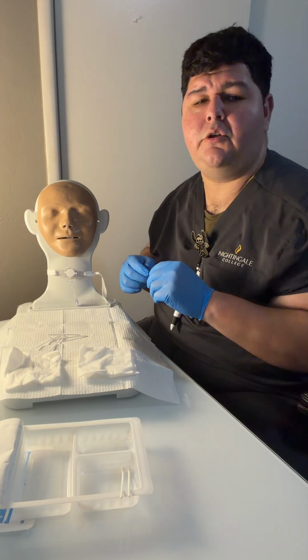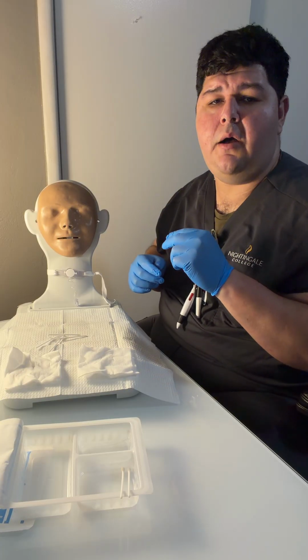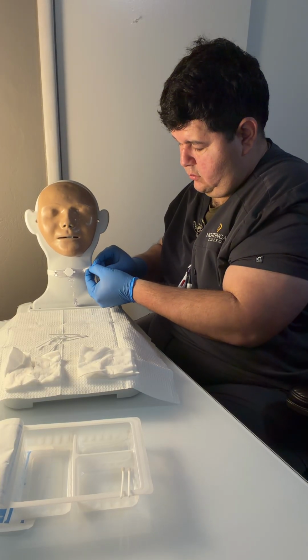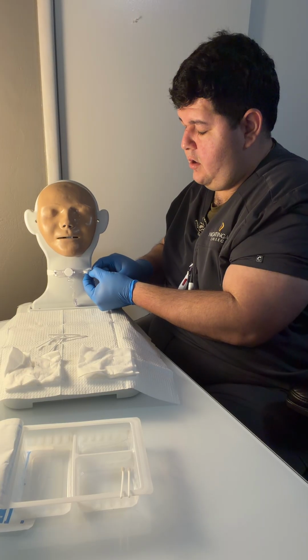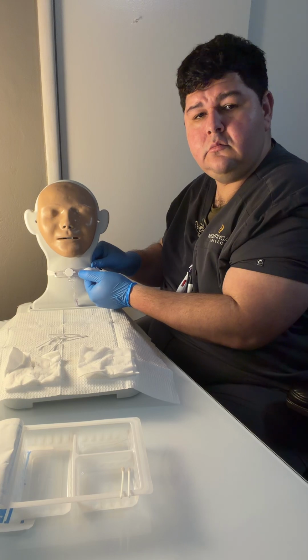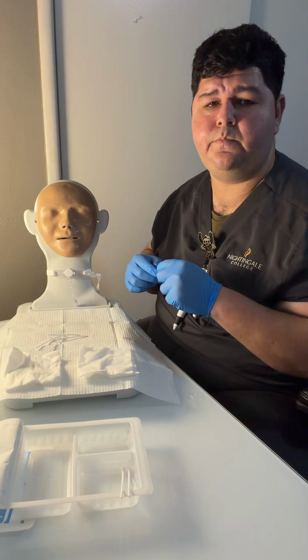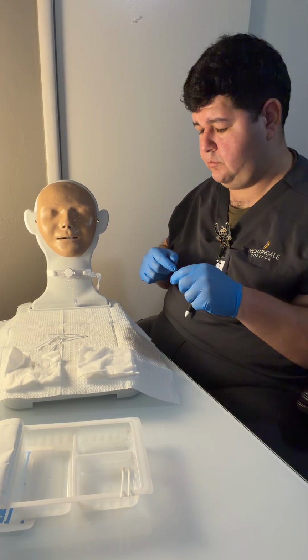At this point, I'll check the tightness of the tie, and I want to have the 2-finger width to be able to stick my 2 fingers through. And again, assuming my assistant's holding on to the trach, I can fit 2 fingers here. And again, we want it snug, but we don't want it too tight to cause discomfort to the patient. At this point, we'll replace our trach dressing.